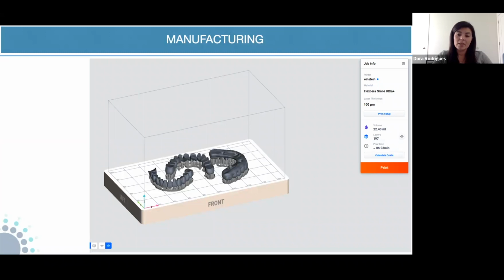That will be the printing time for a prototype that, if you do it the same day, the entire digital workflow that we're going to talk about in part 3, that will be the time that it would take to print that same day for the patient.